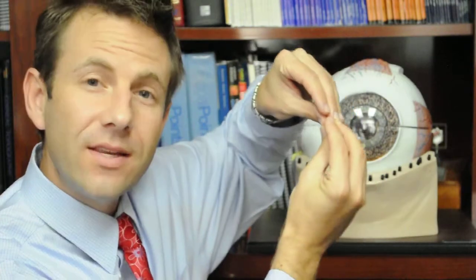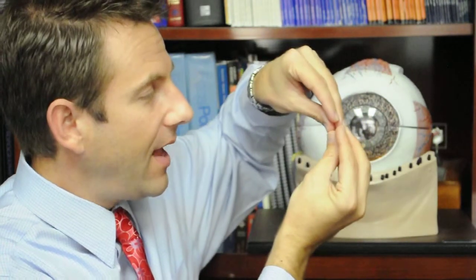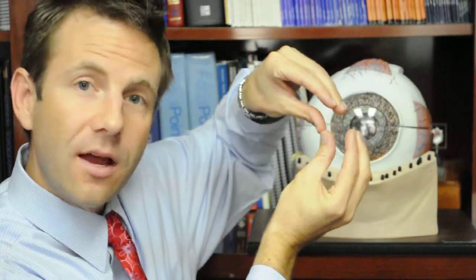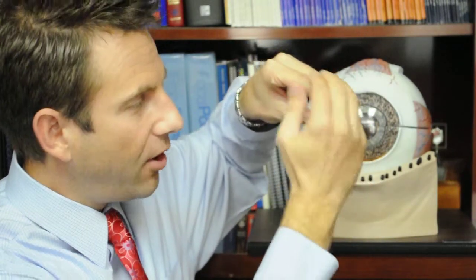Where the cornea is too steep, this incision goes through most of the depth of the cornea and allows it to open some and relax where that curvature is not so steep anymore.